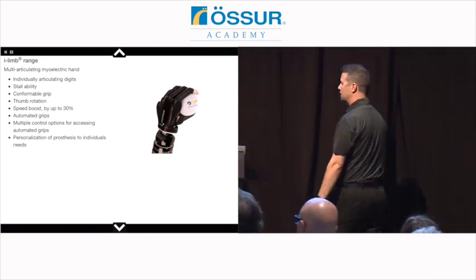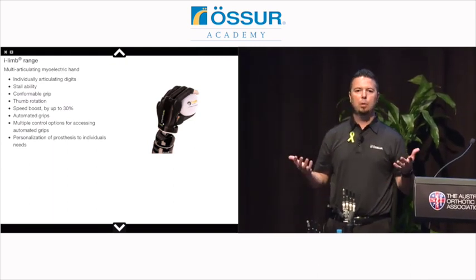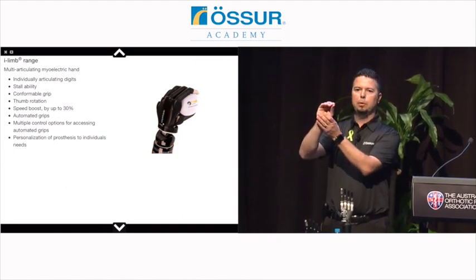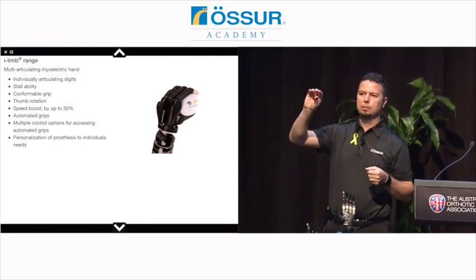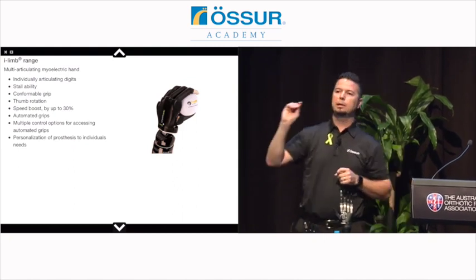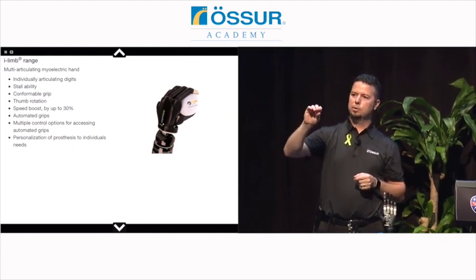All right, so why is that important? Well, in the 50s, when the first myoelectric hands came out, if you wanted a myoelectric hand, you had to get a hand that had one powerful motor in the palm, would drive these three fingers together, and these two were not powered, right? They were just along for the ride. You've seen those hands, right? They're still available today. I'm not saying it's a bad hand. It was just limited because it had one motor and limited articulation points.